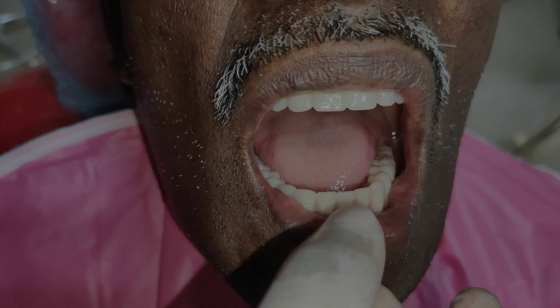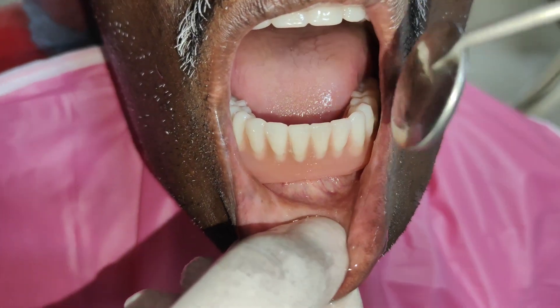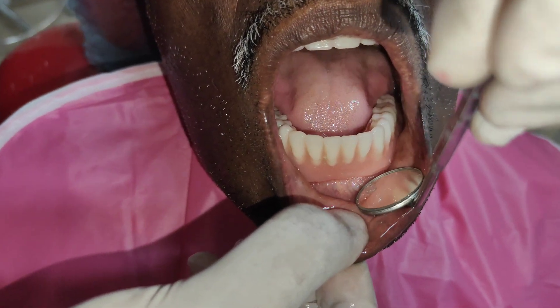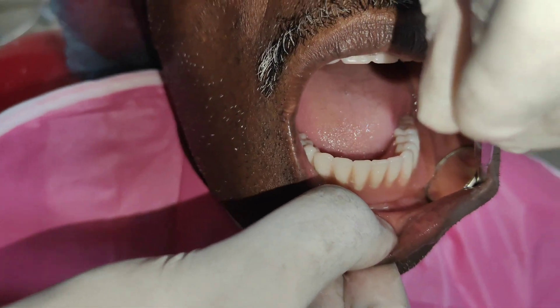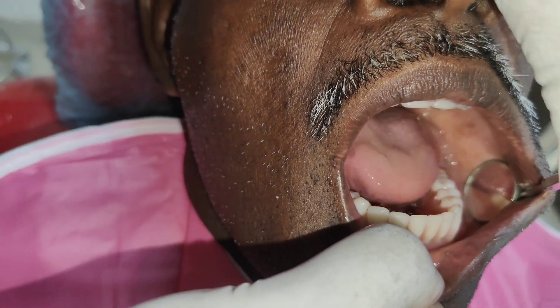In the mandibular denture, the peripheral adaptation is checked all over the labial and buccal vestibule. Proper frenum relief should also be given in the labial and the lingual frenum of the mandibular denture.